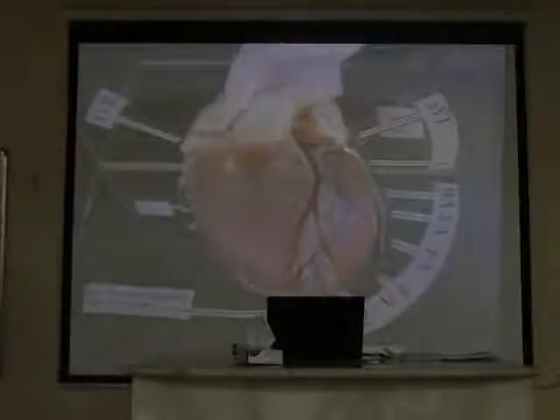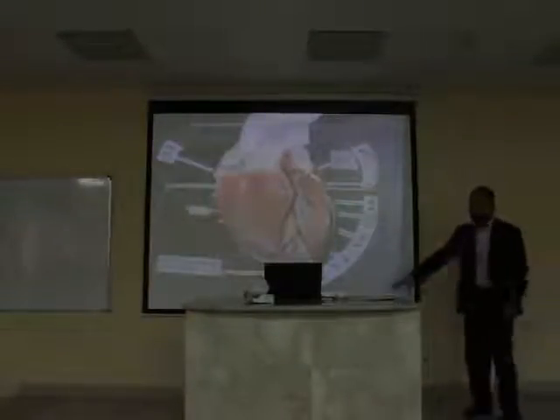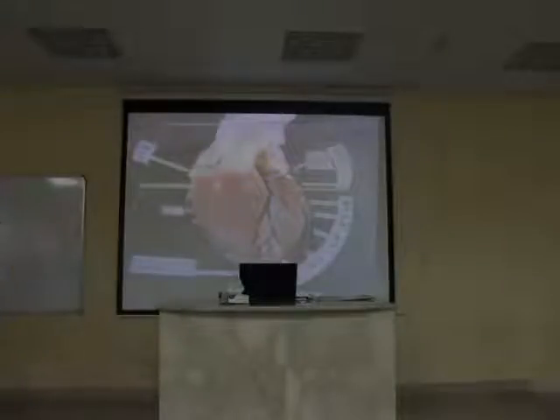Imagine this is the heart. This whole area is the heart. You want to see the heart from different angles. This is one side of the heart, this is the front of the heart, and you are moving to the other side, the lateral side of the heart, in this way. So all around, at the horizontal plane, you want to see the heart as a camera.